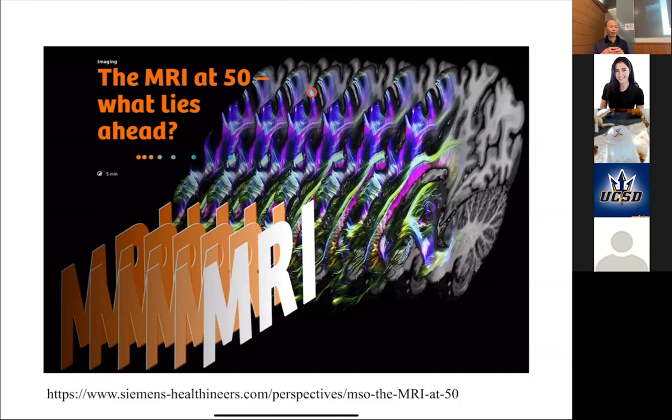The main issue that comes with the fields, from a practical point of view, getting back to your motion question, is that if a subject moves their head around, especially at the openings of the magnet where the fields are changing a lot, that's actually creating a dB/dt, okay? And that induces currents, especially in your brain. It's happened to me a couple of times. I don't recommend this, but if you went to a magnet and just shook your head at the opening, you might feel dizziness, some nausea, or see some flashing things in your eyes. It's essentially you're zapping your brain with electricity, using Maxwell's equations. Okay. Basically, yeah.